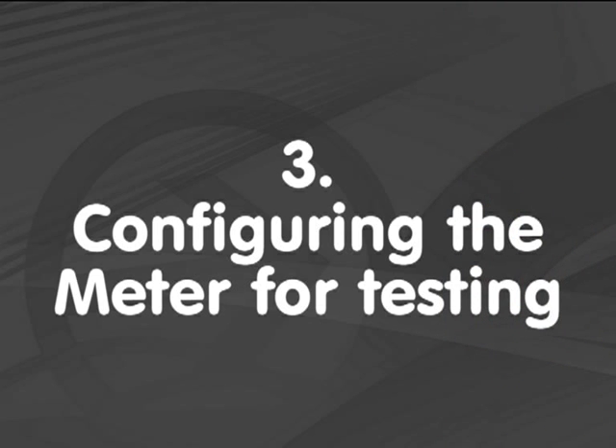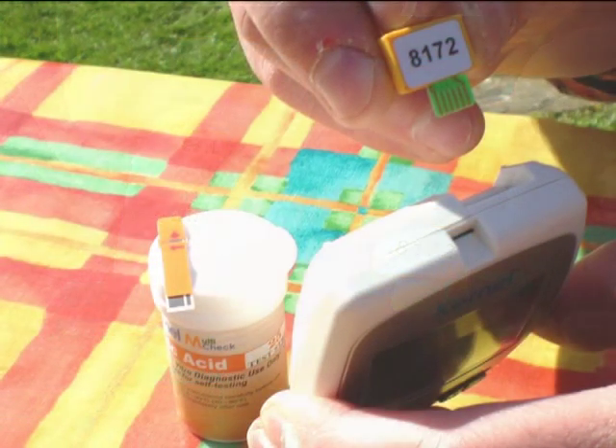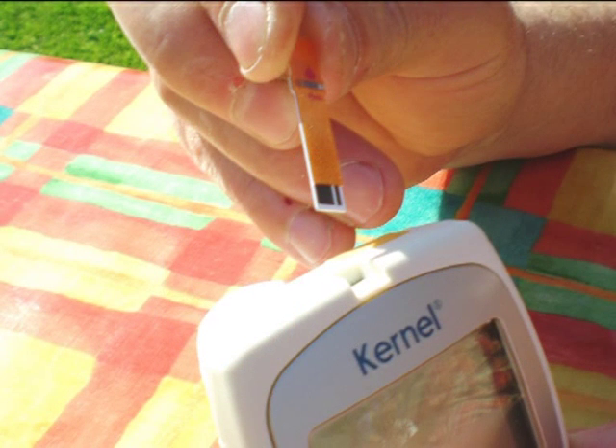You then need to prepare the meter. First of all, open the tub and remove a testing strip and the chip. Make sure you put the top straight back on the tub as this helps to preserve the life of the strips. Check the code on the chip corresponds with the number on the tub before inserting the chip into the back of the meter. To then start the meter, insert the test strip into the top of the meter with the coloured side of the strip up.